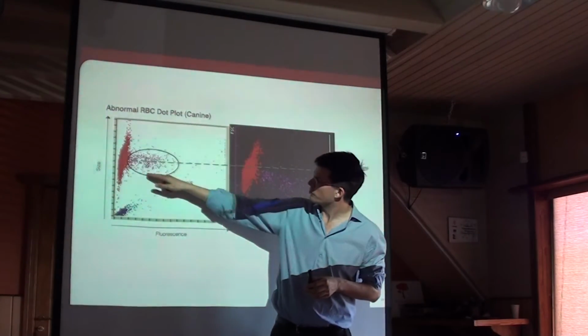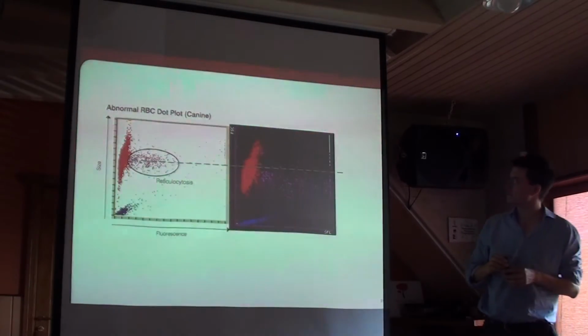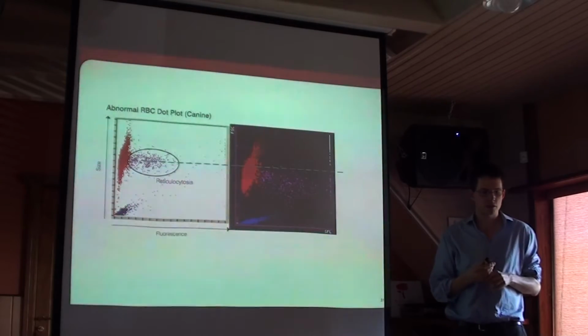Here we have a lot of reticulocytes from a busy bone marrow. Ignore the fact that the color background is different on this one, but what do you think to the reticulocytes from this patient?